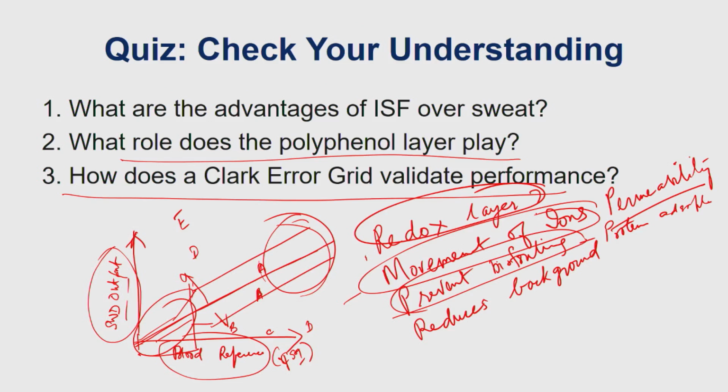So definitely microneedles have a clear advantage over normal needles. Why don't we see microneedle-based products in the market right now? That's because microneedles were introduced a long time ago, in the 1970s. The first microneedle product that's going to come into the market is going to be a ketamine patch, a clinical application.